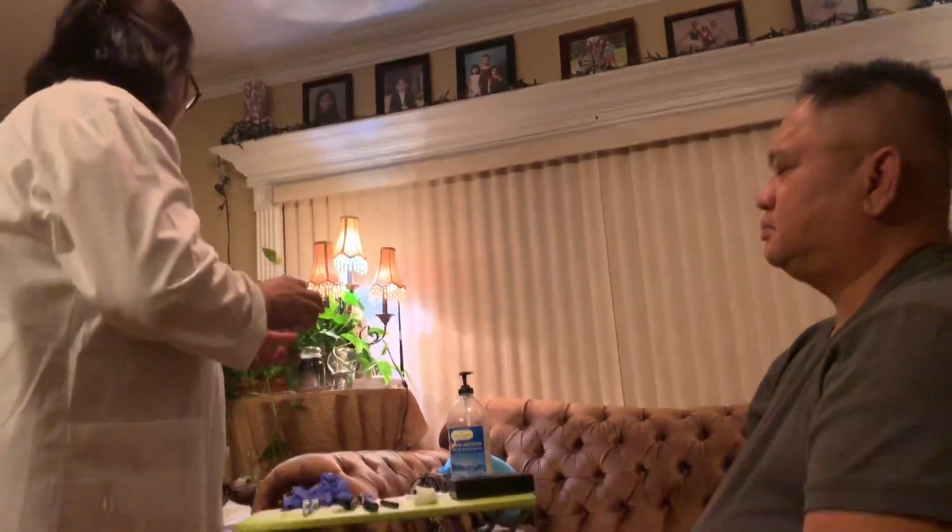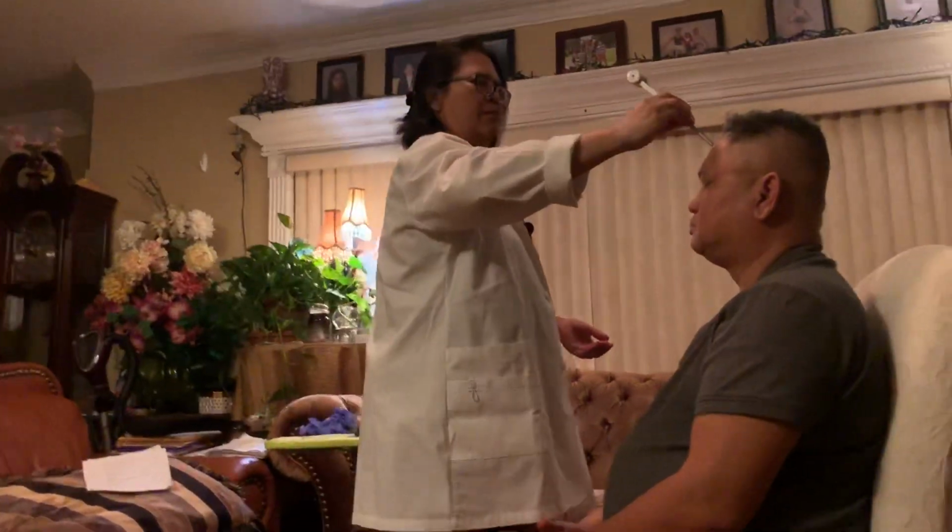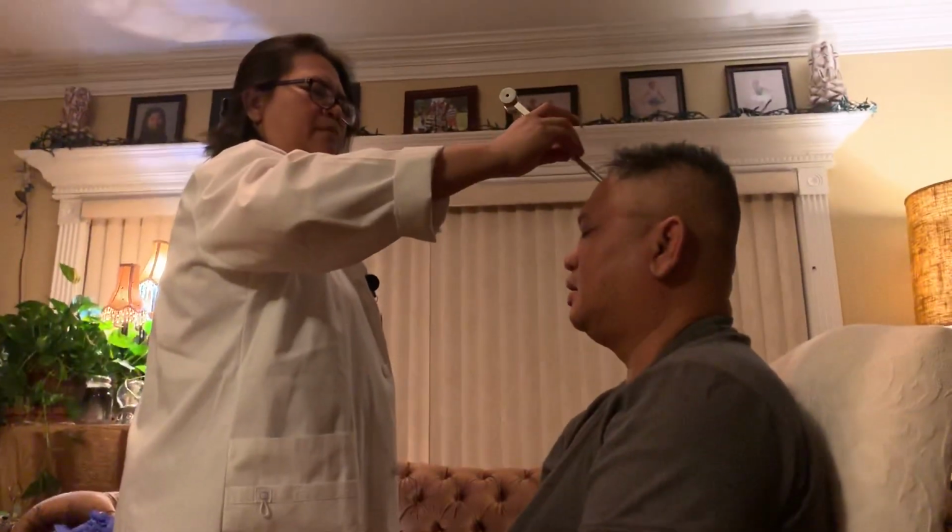The next test I'm going to do is the Weber's test. With the Weber's test, I'm going to ask you to tell me if you can feel the vibration on both of your ears. I'm going to put the tuning fork on your forehead. Yeah, I hear it. Both. Okay, thank you. The next test that we are going to do is called the Rinne test.